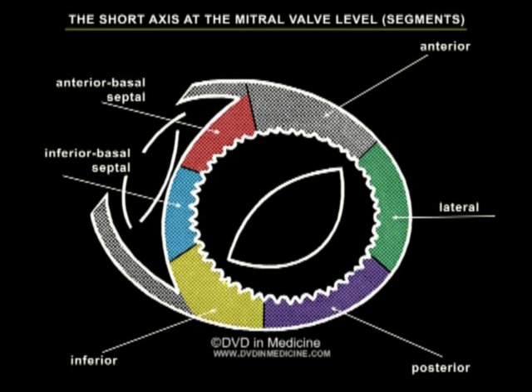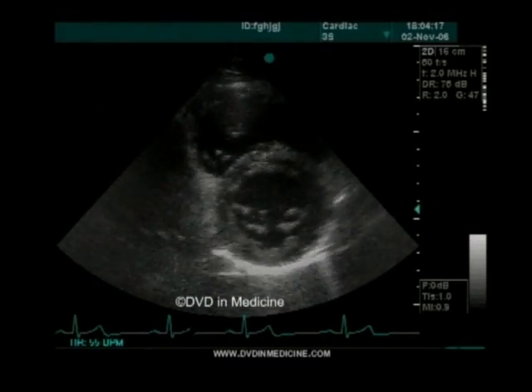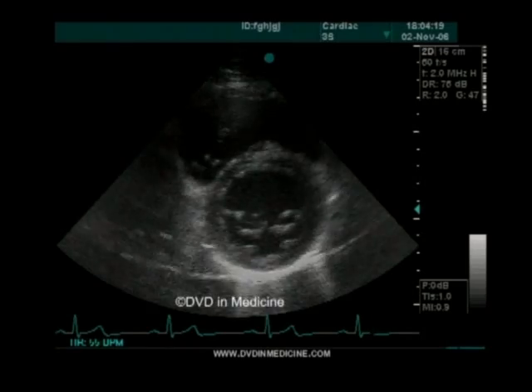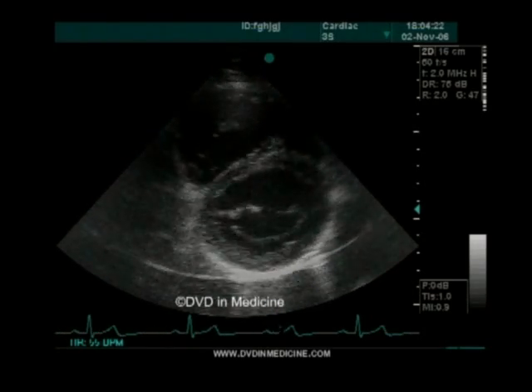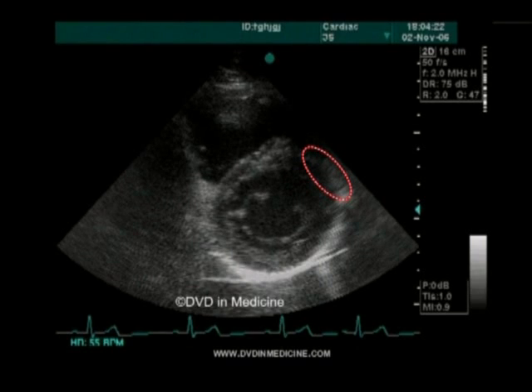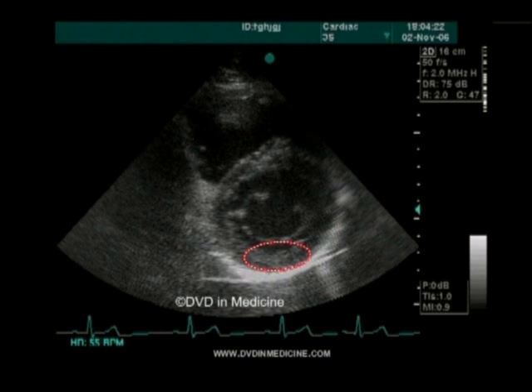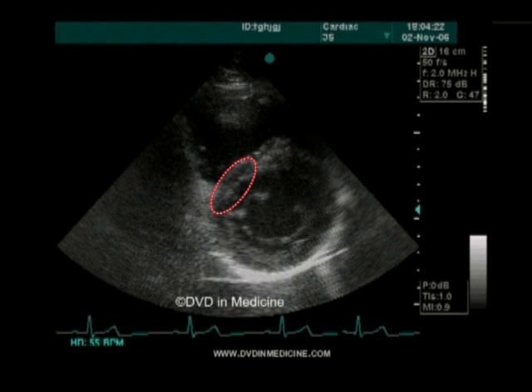On this scheme, one can see the short axis at the mitral valve level, with the following segments: anterior, lateral, posterior, inferior, inferior basal septal, and anterior basal septal.